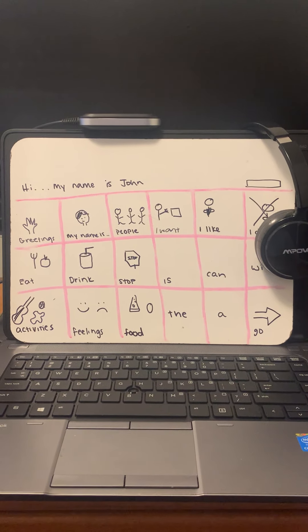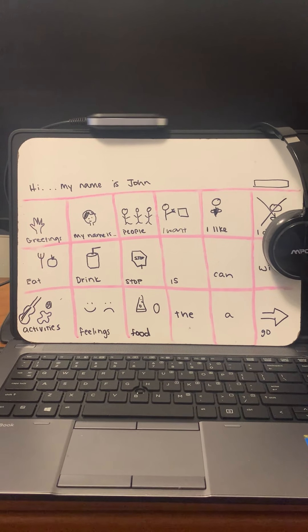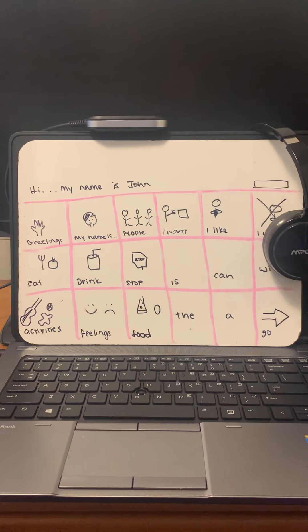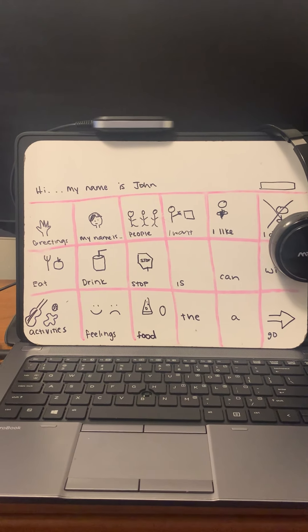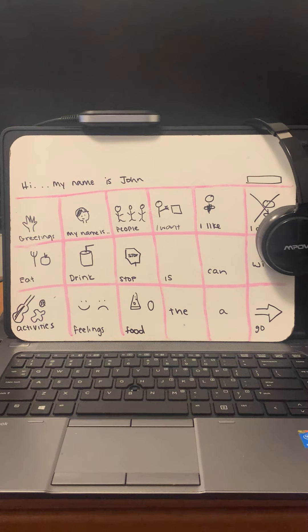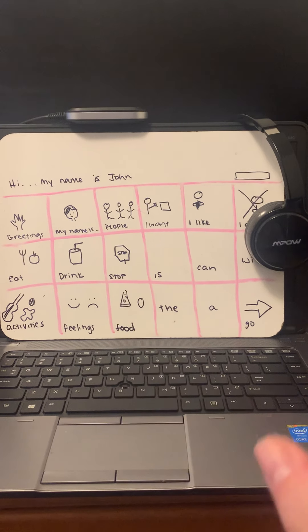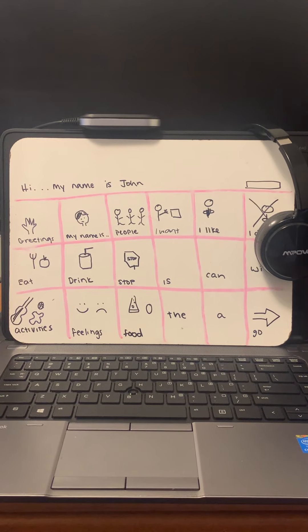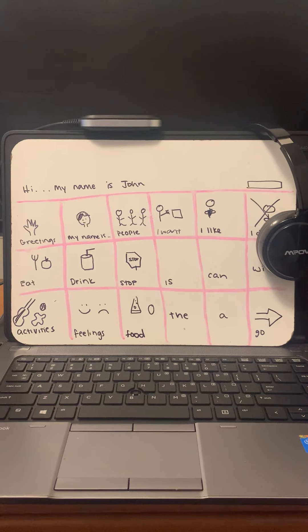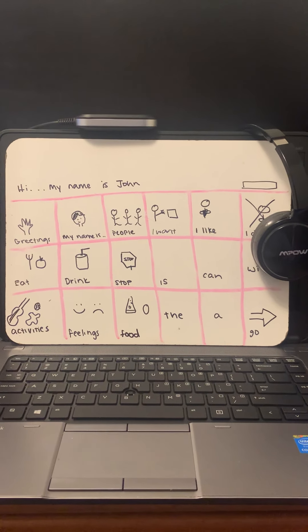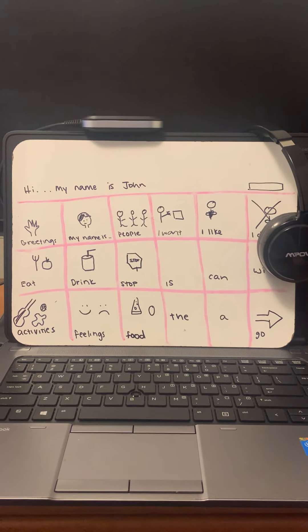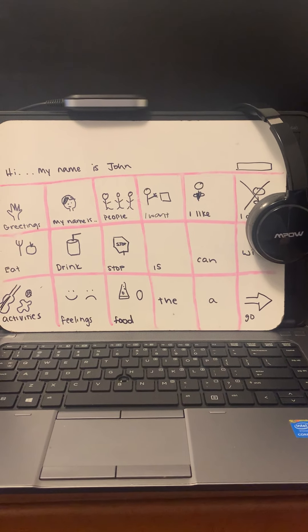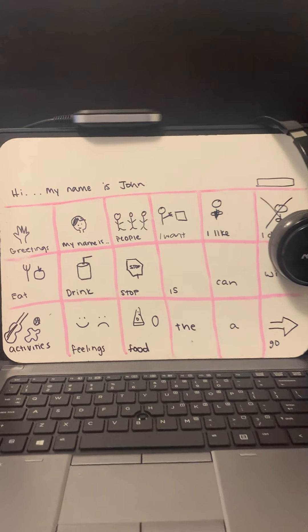If he's using this for English content, we can change the English content section to make it so John is using more vocabulary-focused words from his specific lessons. If he's in math and learning multiplication or division, we can add those into a math category. It can be changed for every content level and every situation — the more John grows, the more we'll grow his AAC device.